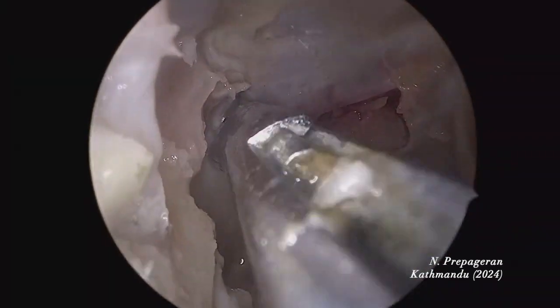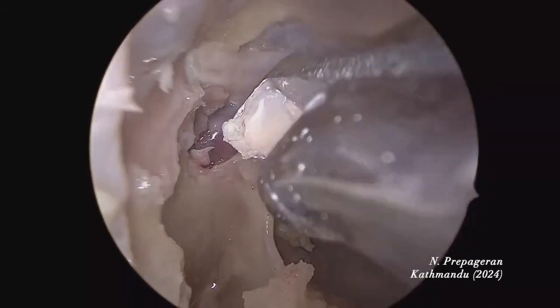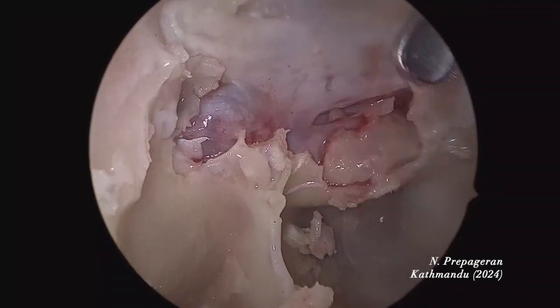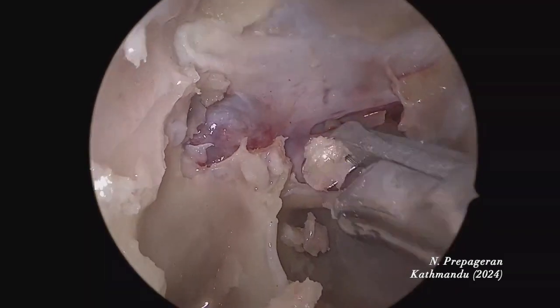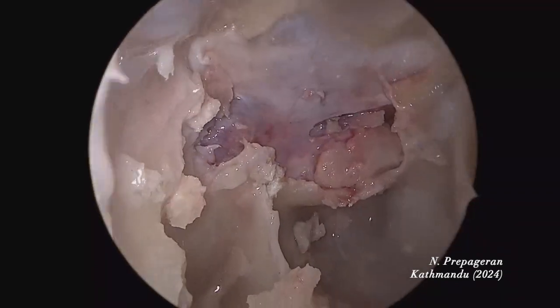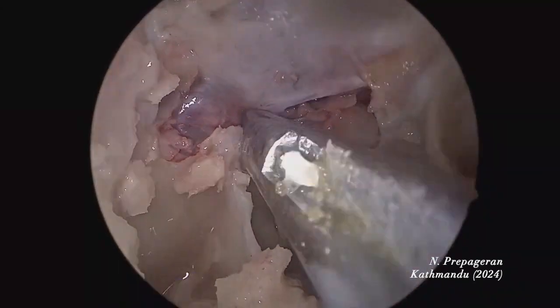Most of the injuries to the carotid artery siphon are caused by drills. Let's expose all the dura before we open it up. I'll go through the entire anatomy again — planum and whatever — after I open all the dura. Can you see R3 exposed? Can you imagine drilling over this? Your bone dust gets everywhere, and you won't be able to appreciate the anatomy as we are doing now. But for the clivus, drilling is very important.